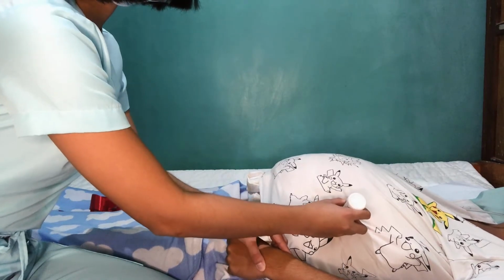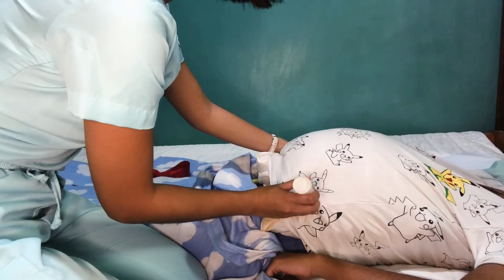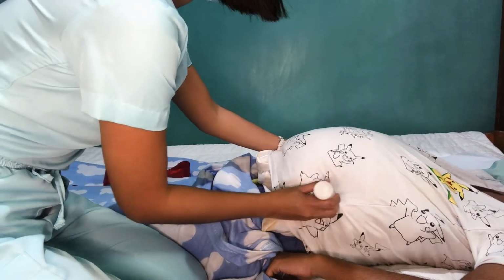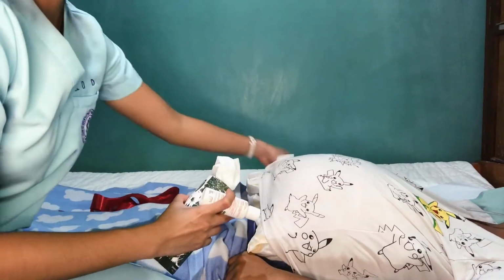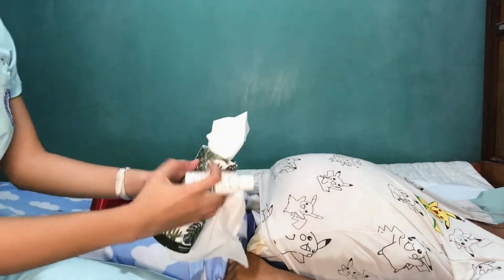Compare audible heart sounds to the mother's pulse and reposition the probe as needed. Count the fetal heart rate in 1 full minute. After you're done listening to the fetal heart rate, wipe off the excess gel and assist the patient.